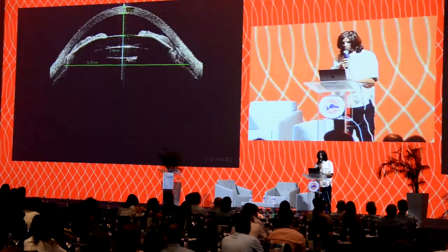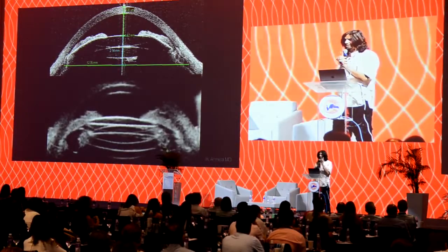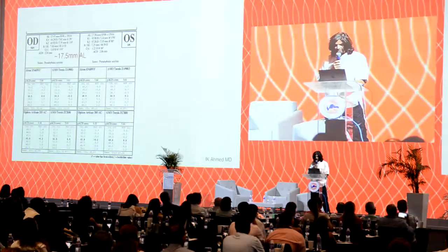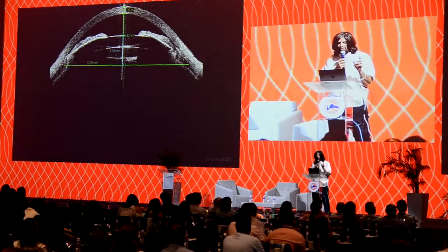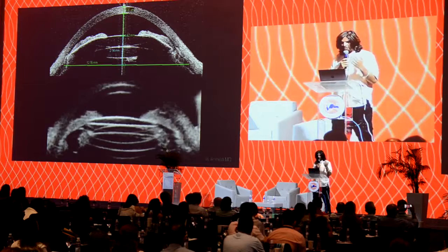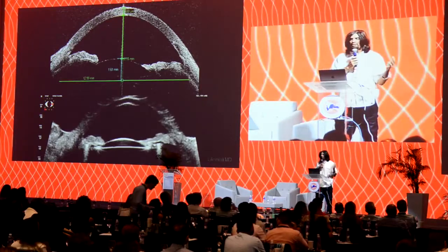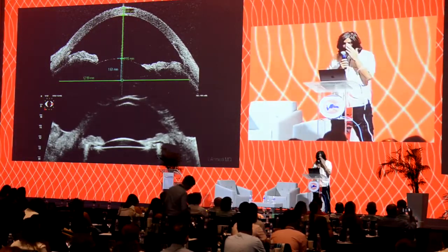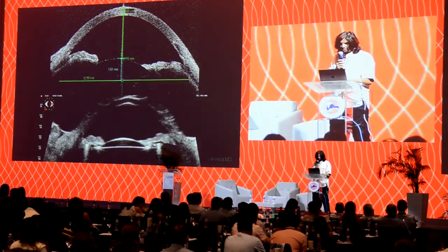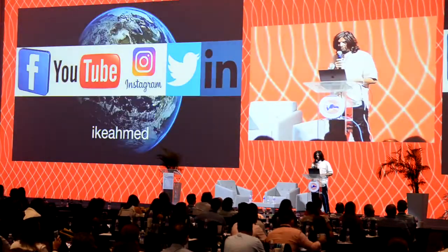For the last minute or so, I want to just show you why it's not a good idea to run overtime. I'm kidding. It's not a good idea to place two lenses in a small eye. This is a 17 millimeter eye with two lenses. Not a good idea. These patients have angle closure, synechial formation, interlenticular opacification. We have to go and remove both lenses from the eye and put a high power lens in the capsular bag there for this situation as well. And I think that's very important to remember the concerns around two lenses in the small eye. In the regular eye, though, it's fine.